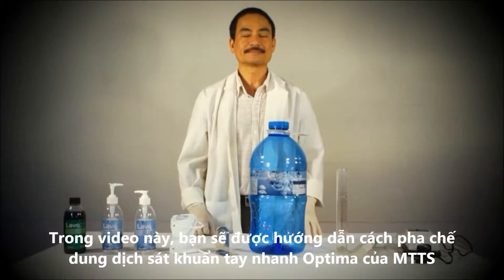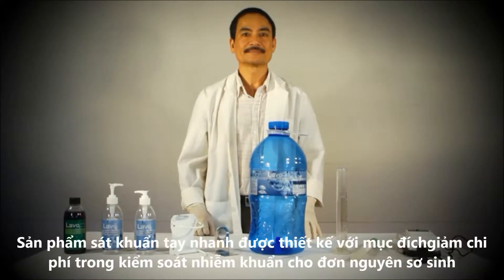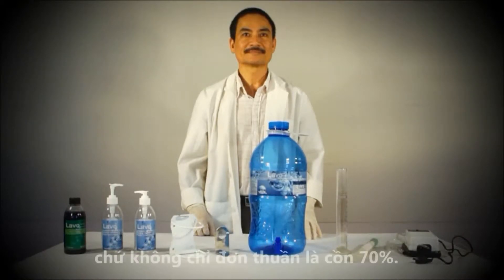In this video you will learn how to prepare the hand sanitizer from MTTS. The hand sanitizer system is designed to reduce the cost of infection control in newborn care units. The video will introduce you to the hand sanitizer kit, which includes all the ingredients and tools you'll need to make hand sanitizer solution, other than the 70% alcohol which your hospital can source locally.